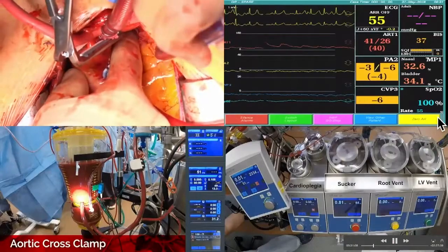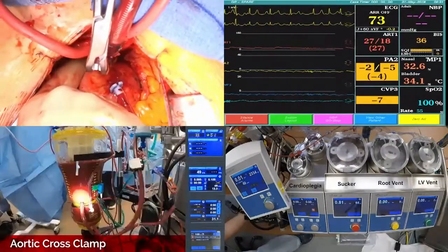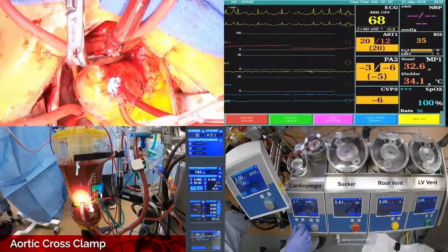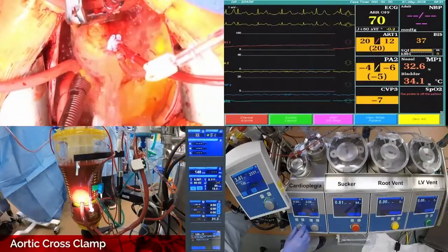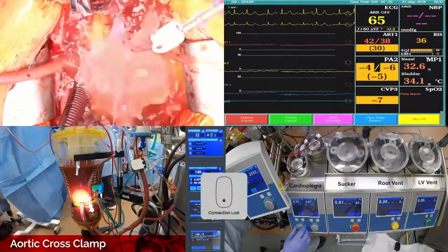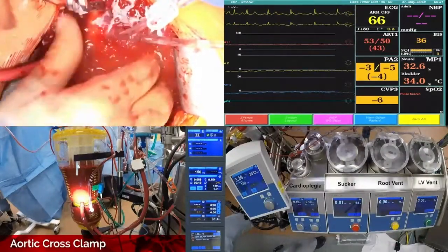Watch the flow come down. It's down, pretty much off. See that? And I'm squeezing my fingers, trying to get as much as I can. Look at the blood pressure drop. You're going as deep as you can, and we're helping that by lowering the pressure. Now look, he came back up on the flow. Came back up on the flow, and look at the pressure. Nice. Here we go.